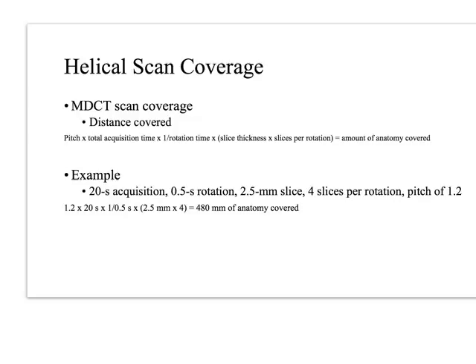And they don't just pull those numbers out of thin air. Every number of CT slices is a binary number. So what does that mean? It is a factor of 2. It's 2 to the something. So for example, an 8-slice machine is 8 slices because it's 2 to the 3rd power.